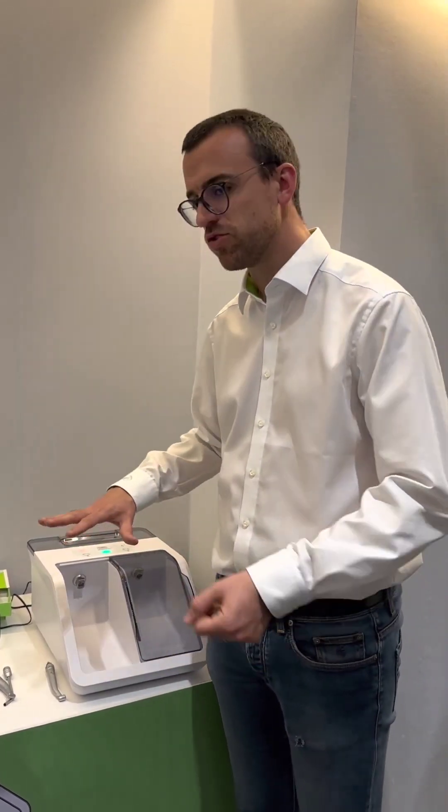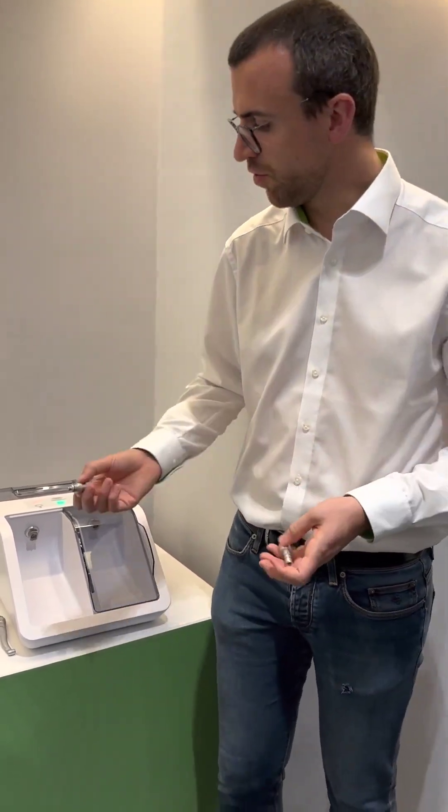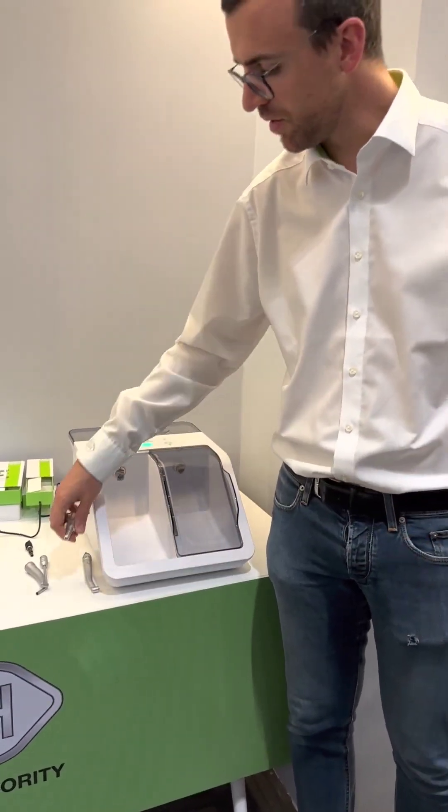That's it, more or less, on the Sistina. If you have additional questions or doubts, feel free. If you want to play with the MPCs to see how to connect, feel free.